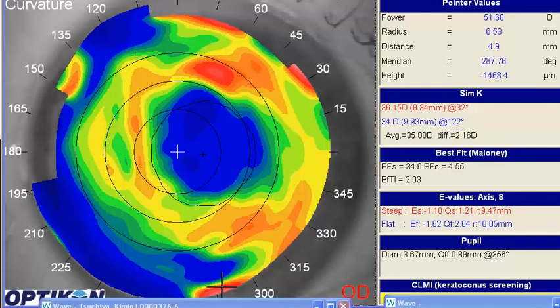I see from your clinical request you're struggling with this patient's vision in a single vision lens after refractive surgery. And as you probably know, with these patients who've had refractive surgery, quite often the rules go out the window because the corneas are so irregular. What I found in my own experience is that quite often I get some strange over-refractions, some strange distortions, some strange cylindrical effects that I just can't quite explain with basic optics because of these distorted corneas.